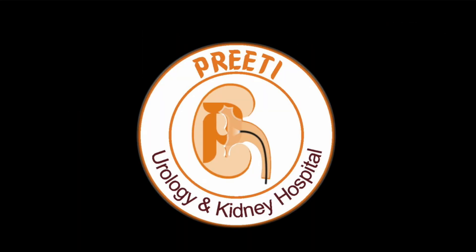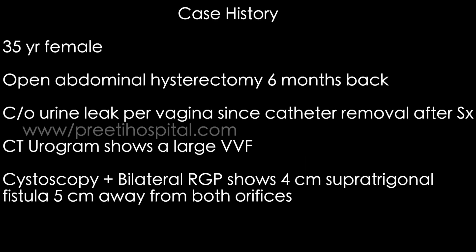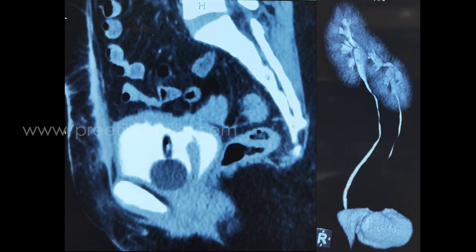Here is a case of my first robotic VVF reconstructive surgery — that is the vesico-vaginal fistula repair. A 35-year-old female patient had an open abdominal hysterectomy six months back and complained of urine leak per vagina since catheter removal after surgery. CT urogram clearly showed VVF. Cystoscopy and bilateral RGP shows a four-centimeter large supratrigonal fistula, which can be clearly seen in the cystoscopy lateral view.